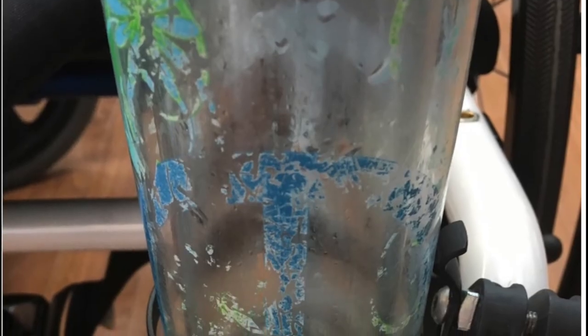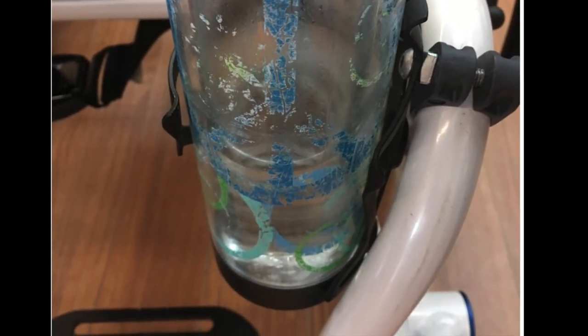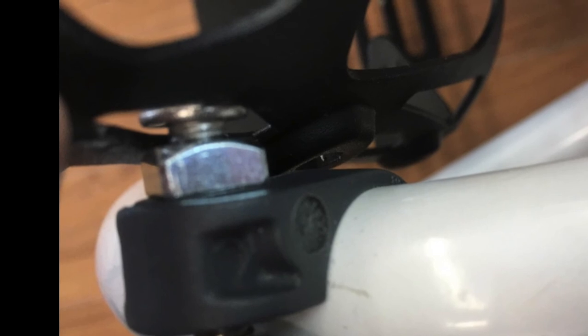Ta-da! You now have a removable cup holder on your chair. I find it gets in the way of transferring, so whenever I don't have a bottle in it I just slide it up so that the head of the screw passes through the wider part of the cage and chuck it in the bag on the back of my wheelchair.